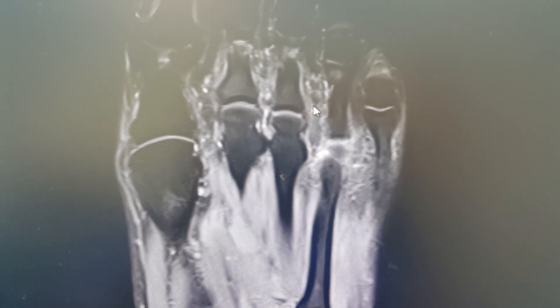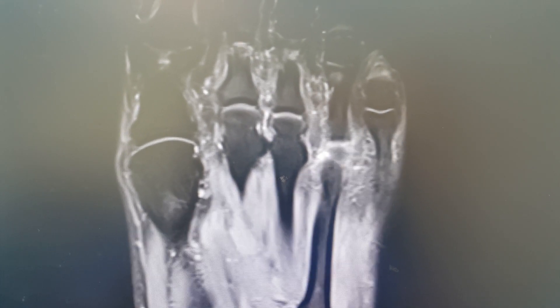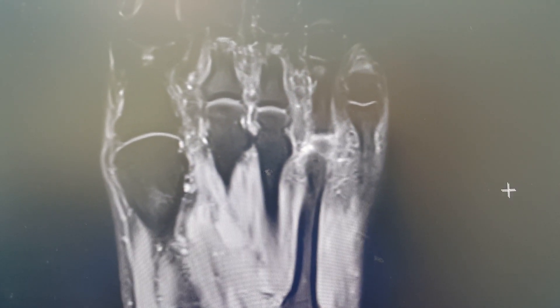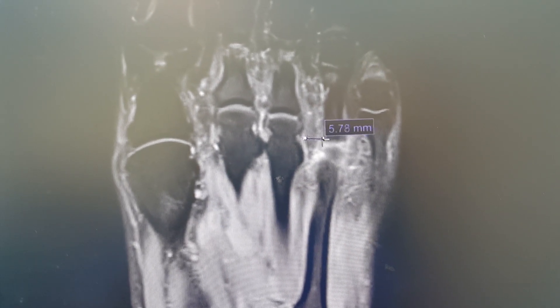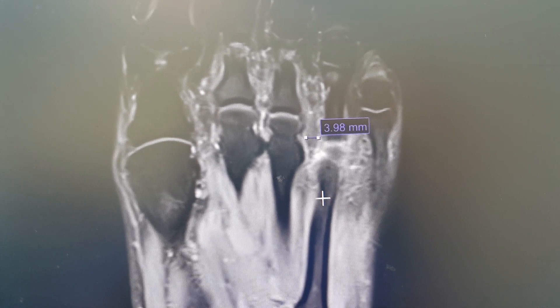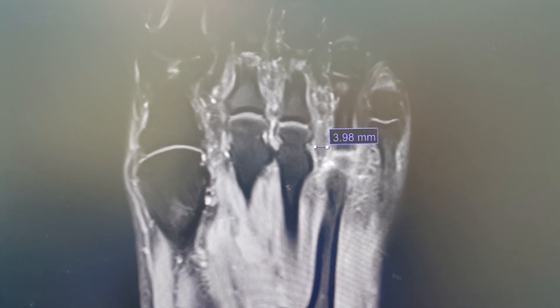It's a fairly enlarged size. This one measures about four millimeters in diameter, so that's a good size neuroma.